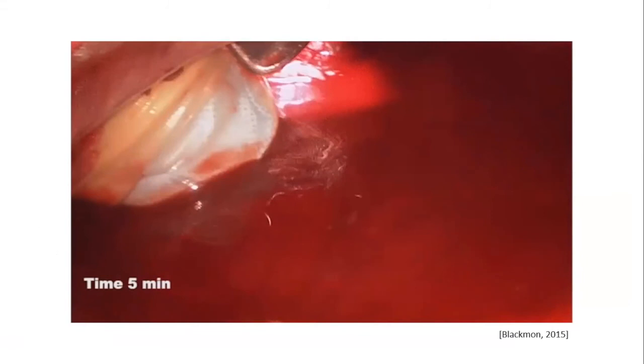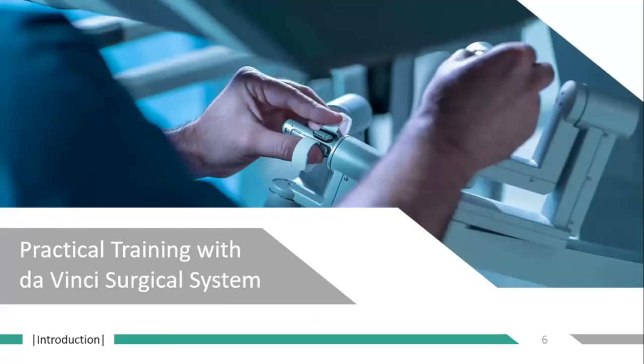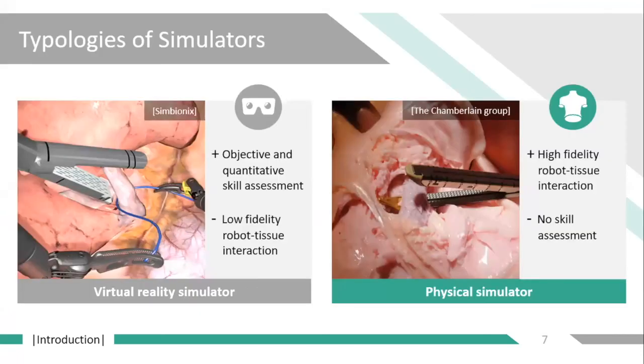And so how do we stop this from happening? The main thing we have is training. It is very important that the surgeon trains before entering the operating room, and it is fundamental that he learns how to deal with the lack of haptic feedback. And this is the option we have right now: simulators.